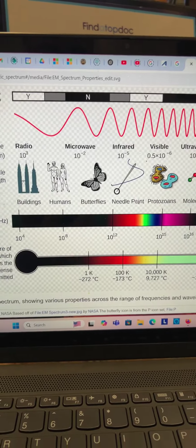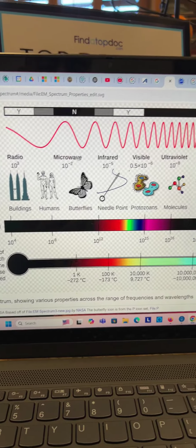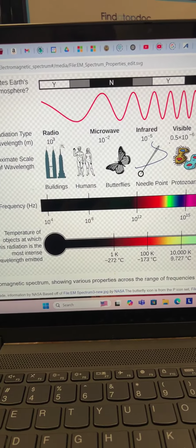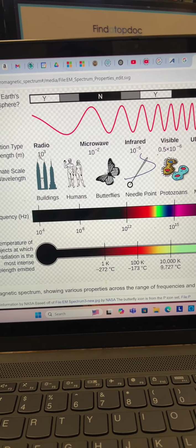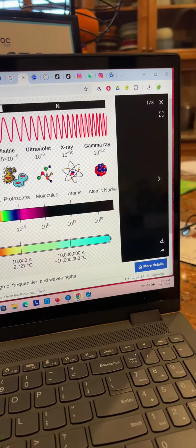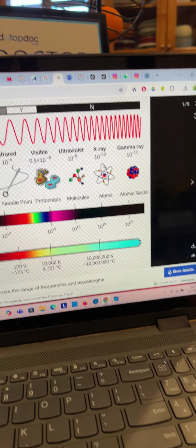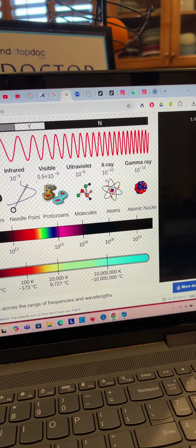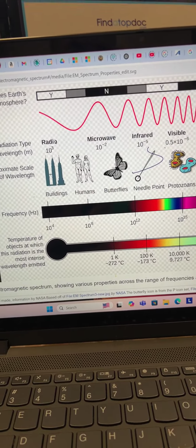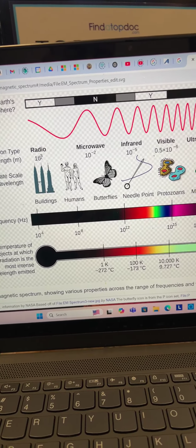So before we get into the images, I wanted to just show you the electromagnetic spectrum. On one end, you have radio frequency, which has very low energy. On the other high end of the spectrum, you have gamma energy, which has very high energy, and X-ray is right behind it. And so MR does not utilize X-ray for imaging. It uses radio frequency, which has lower energy.